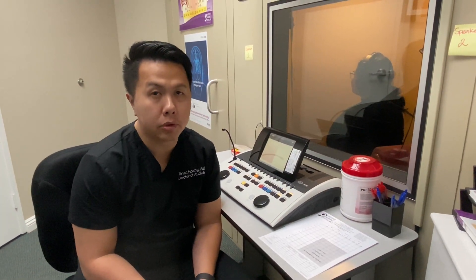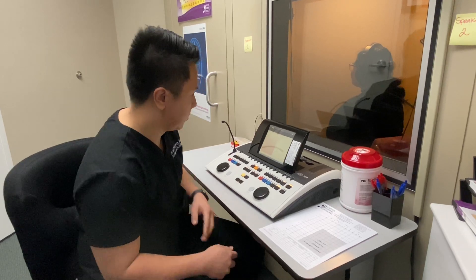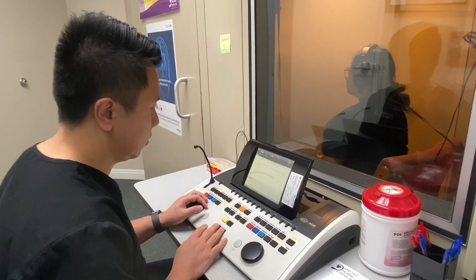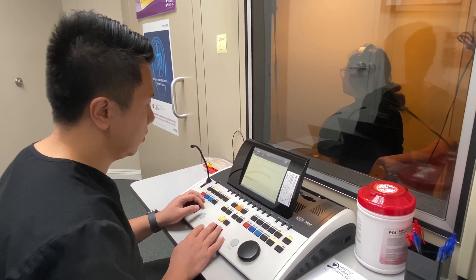At some point in the test the audiologist is going to ask you to repeat some words. Just do the best you can on this part. I'm going to demonstrate it right here with Paloma. Playground. Daybreak. Northwest.